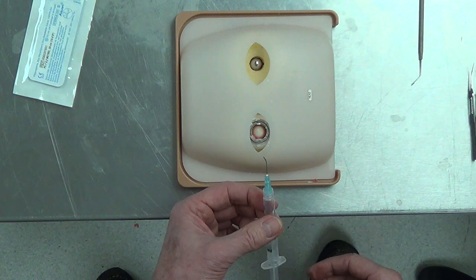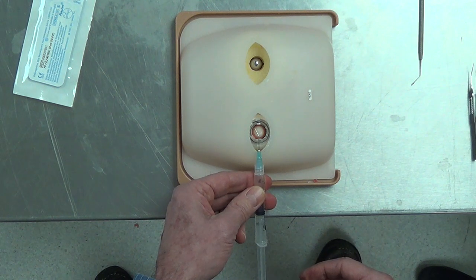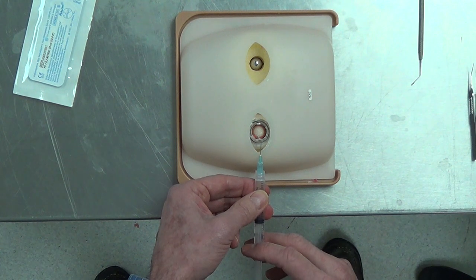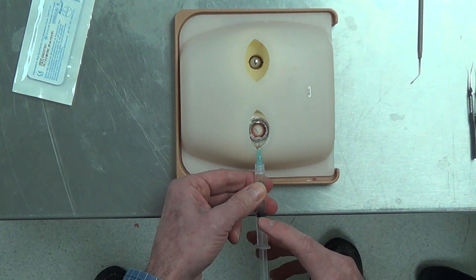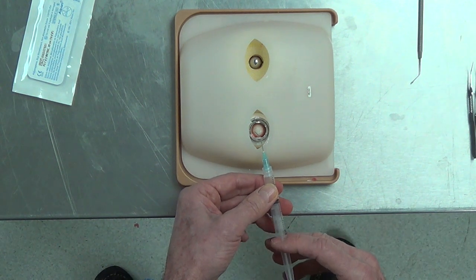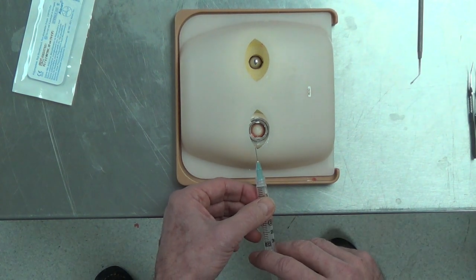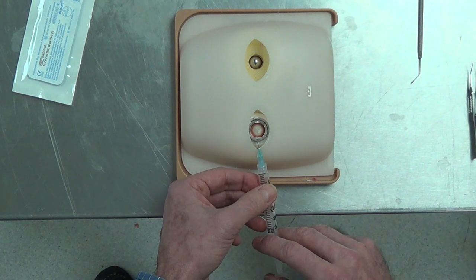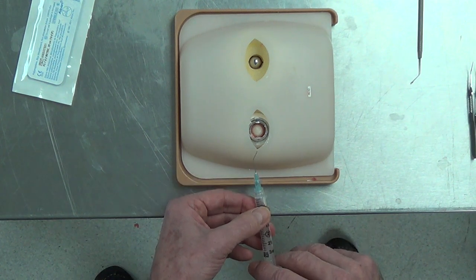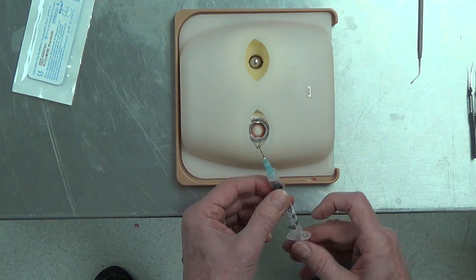I usually hold the syringe so I can manipulate the angle of the tip. Coming in for hydro-dissection in the plane of the wound, all I need to do is rotate it a very small amount — now I'm underneath the capsule and I can inject here, come back, inject here. Sometimes I come out, rotate the instrument 180 degrees, go in again in the plane of the wound, gently rotate so I'm at an angle, inject, and come over here and inject. That's my hydro-dissection using my left hand for fixation, right hand functionally.